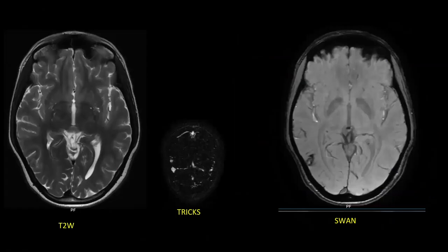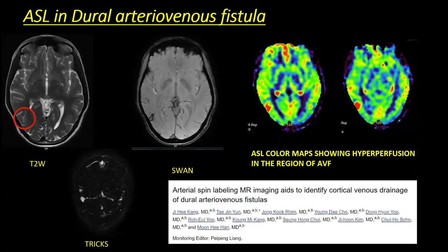Another example: here we see a very small area of abnormality in the right posterior parietal cortical region in the form of a few flow voids. TRICKS — time-resolved imaging of contrast kinetics — was also performed, showing a small abnormal cluster of blood vessels with blooming on SWI images. On the corresponding ASL color map, though this area is very small, ASL picked up hyperperfusion in this region. Literature supports that ASL can detect small vascular malformations like dural AV fistulas, seen as areas of hyperperfusion.